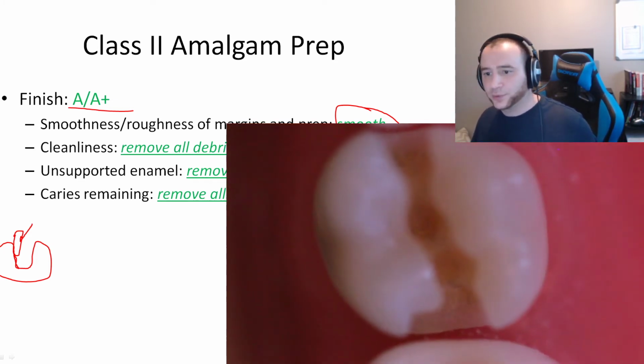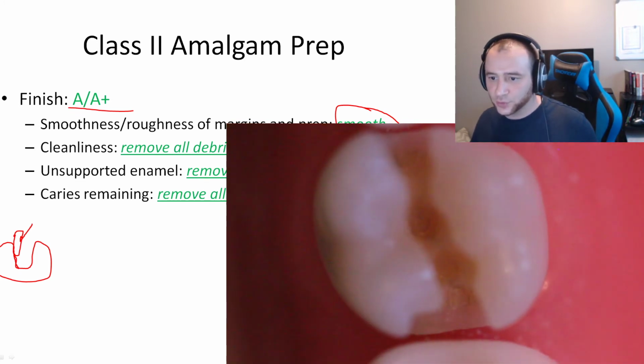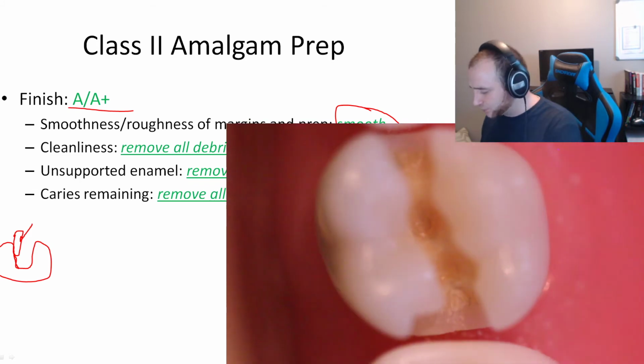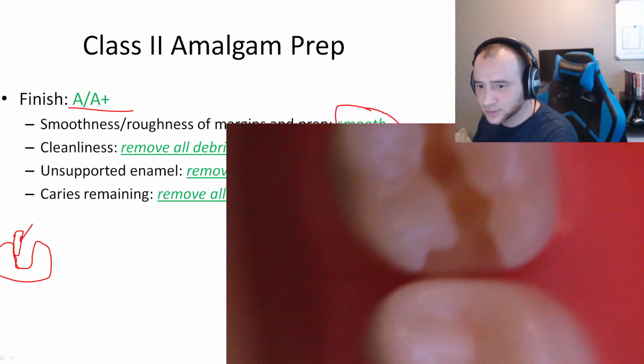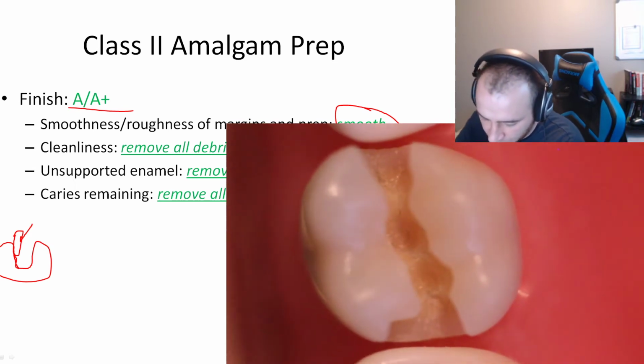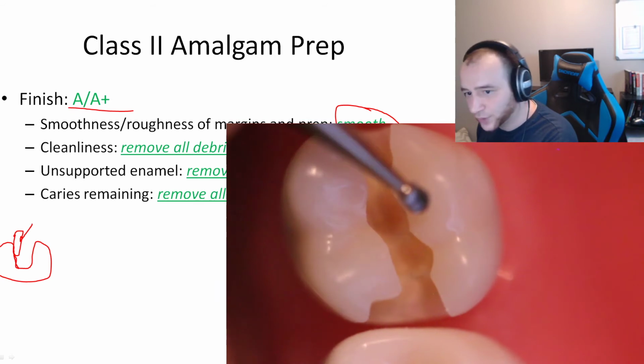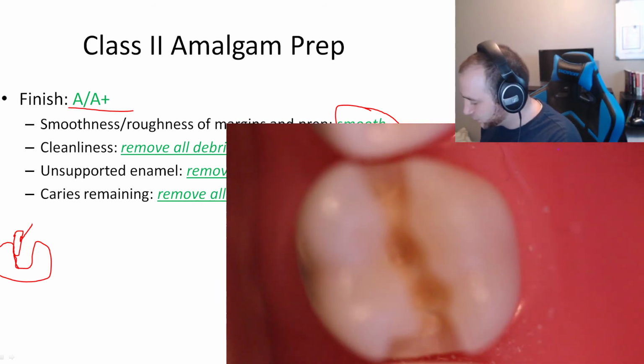So what will happen with caries is that most people are going to try, obviously, to remove it with, what's wrong with it here? Oh, yes, it's because it's not pinned all the way down to the table there. So you're going to want to remove it probably with the slow speed burrs, right? The round burr, slow speed, right? So let's put it on this handpiece here. Oh, this one's too big.